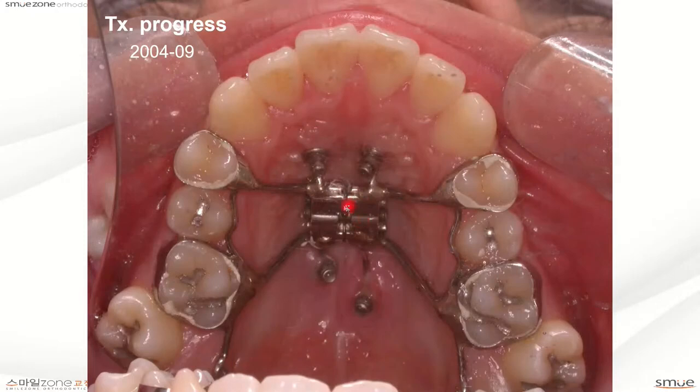And he gave me this picture. He soldered some kind of hook like this one to the normal palatal expander, and he put a mini screw here and here, and to expand this maxilla, especially in the more older people. Эту фотографию дал мне сам доктор Ki-jun Lee.